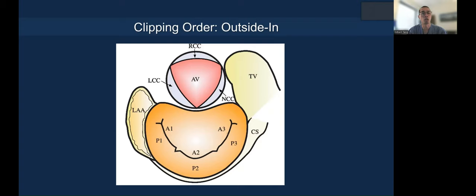How do you decide clipping order? I would suggest that you start with either commissure if there is jet there, and then work towards the center — because if you clip the center first, you produce a double orifice, making the second clip more difficult to navigate from the left atrium to the ventricle.